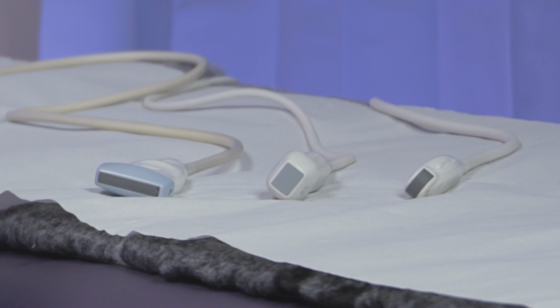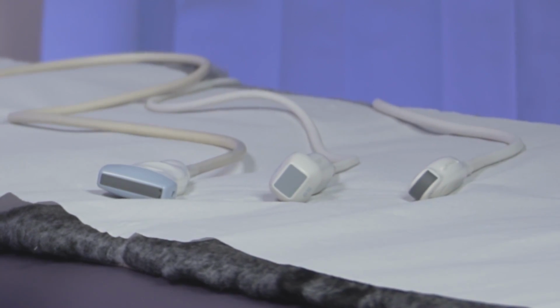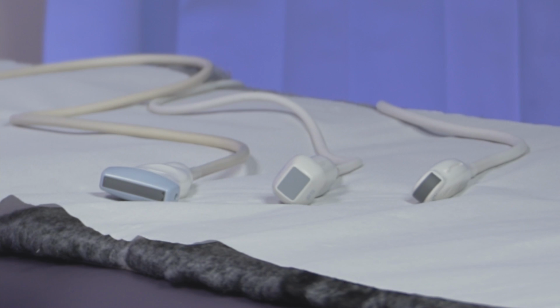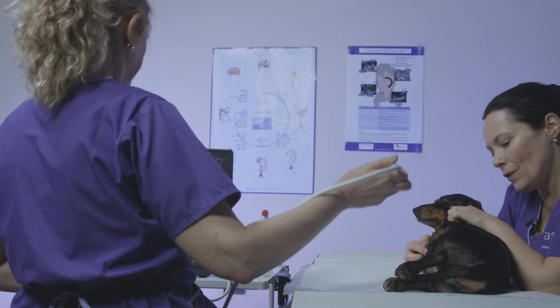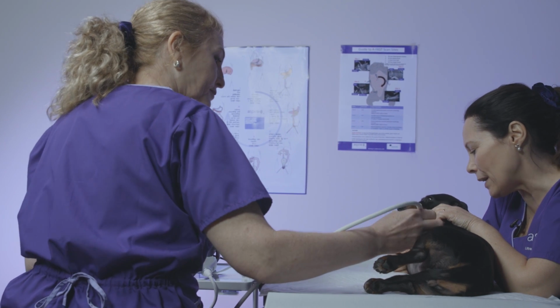Sound is simply the transfer of mechanical energy from a vibrating source through a medium. Ultrasound is a high-pitched frequency of sound which is above the audible human range. Typically, ultrasound probes generate sound at a range of around 4 MHz to 15 MHz in frequency.